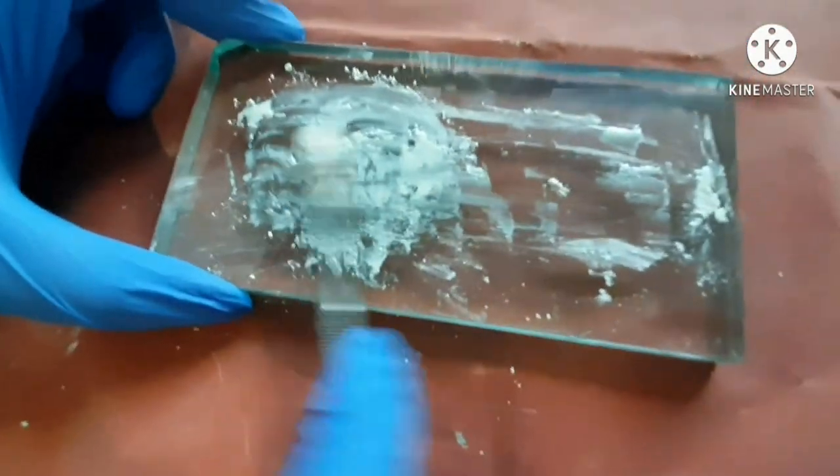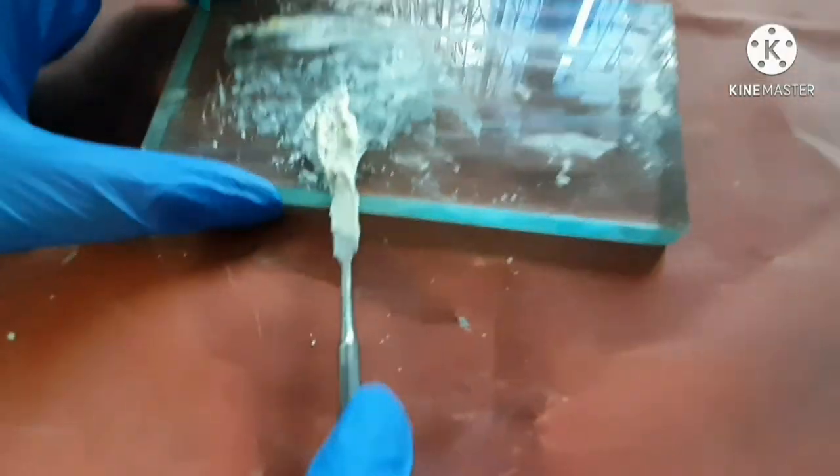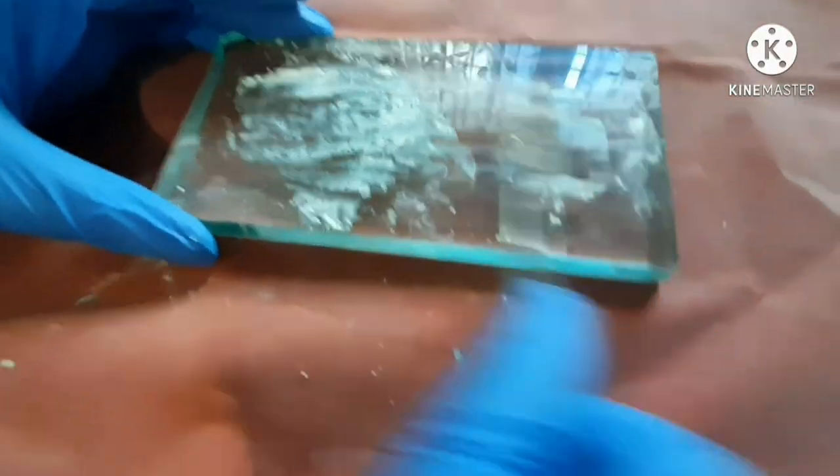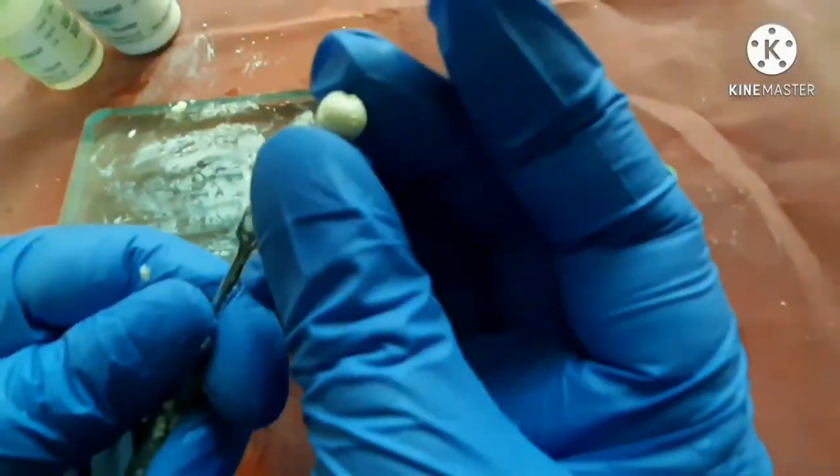Now it is a very sticky material. Now you can see the consistency.